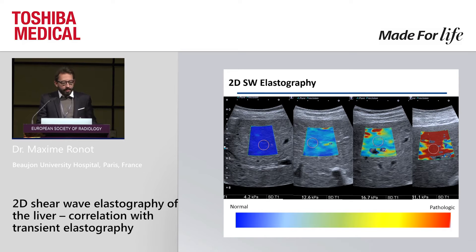This is an example of four patients. You see from left to right a normal liver to a cirrhotic liver, and there is a clear shift from blue to red. So even purely qualitatively you can know if there is something wrong or not. Then you place a region of interest and you will have an objective measurement of liver stiffness.